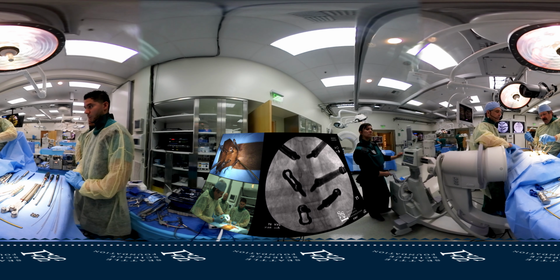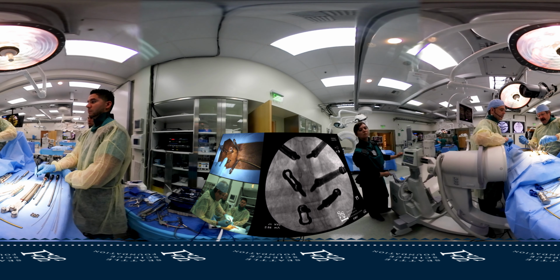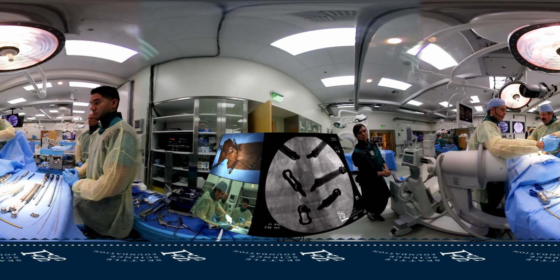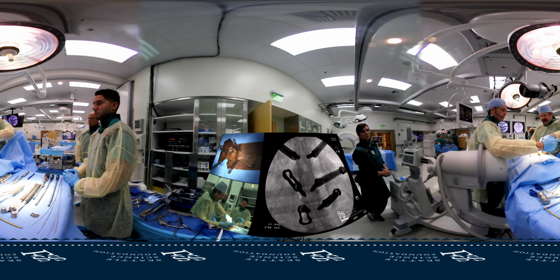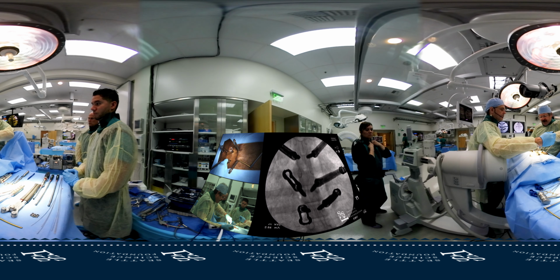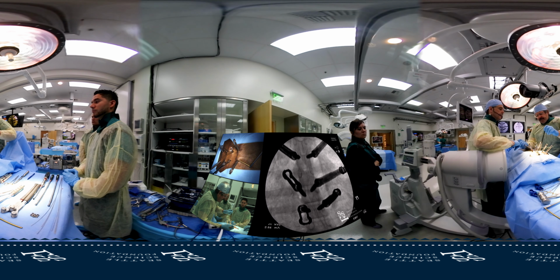And then when I pass the rod, in this particular system, I pass it through the same skin hole. And I'll work it. Once I'm in my first hole, I hold the second one, and I can pass, and I can feel my rod hitting the screw. And by using my left hand on that screw and my right hand on the rod, I get almost a triangulation like you would get during arthroscopy, so I can get a sense of where the tip of that rod is. And once I pass it in this skinny cadaver, I can see my rod through the screw. If I can, great. In a good, fat, nice size West Virginia, you can't do that.